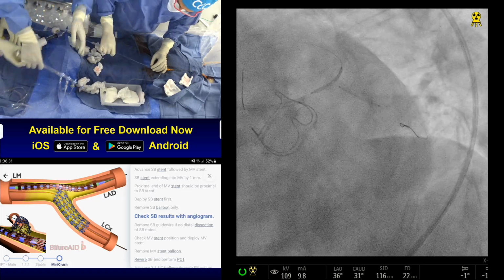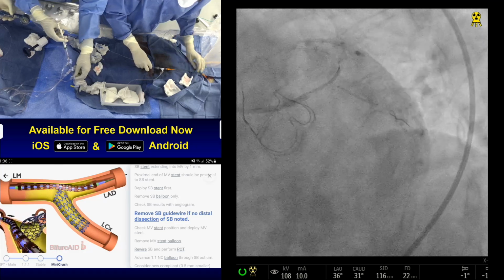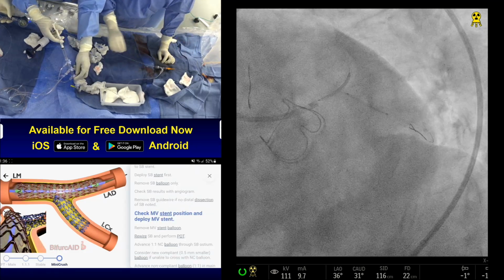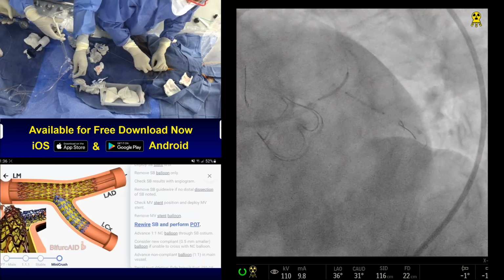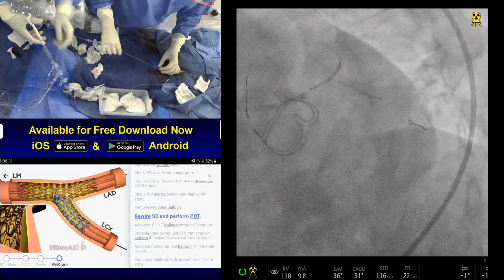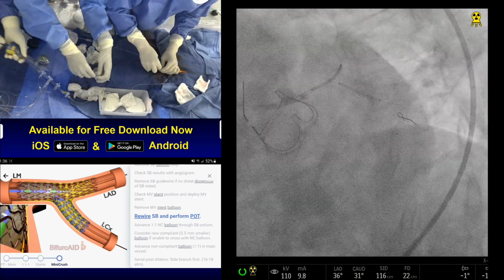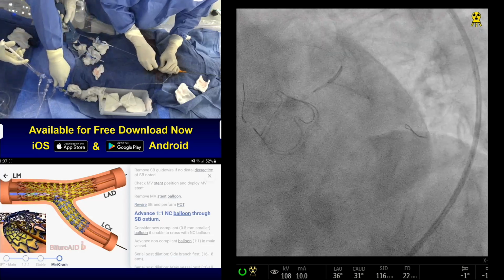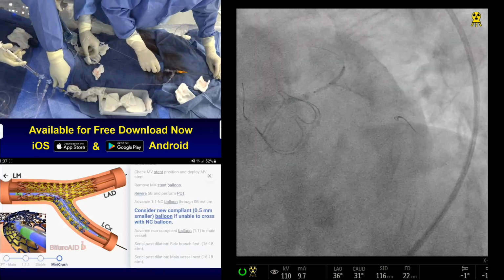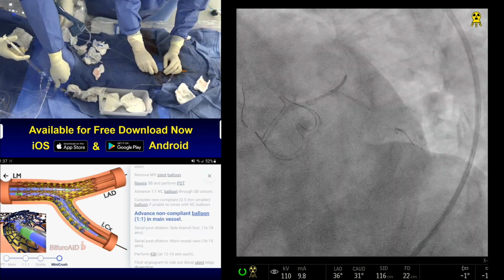Show me dye. So now we are connected with both the stents. I think Megatron with 7 French is in trouble. Yeah, good. Looks good. I have to go in a little bit. I'm going to bring the circumflex a little bit back and you are ready to deploy. Connect. Somebody has to give me dye also. 4.5 by 8 high pressure balloon. Now we don't have the POT balloon. Ready? Here we'll just go with that 4.5 by 8.